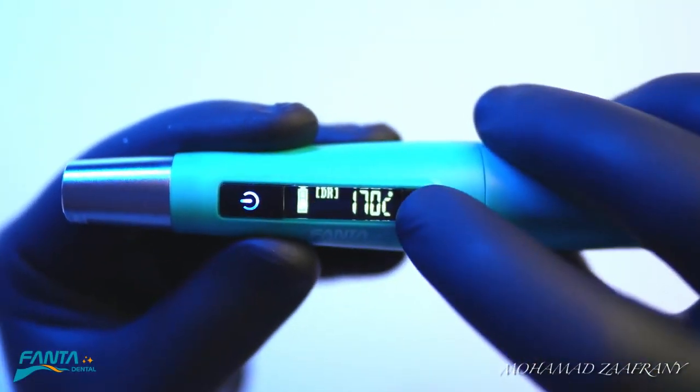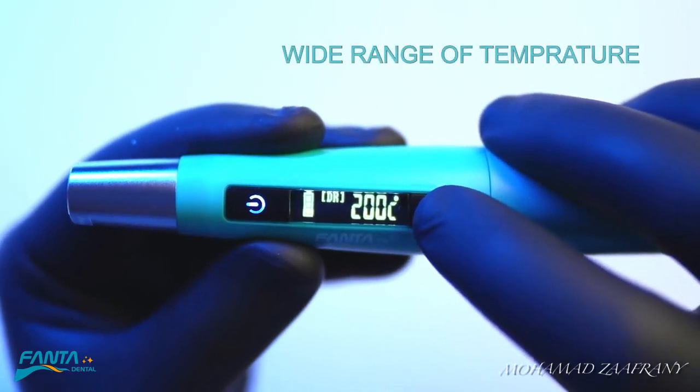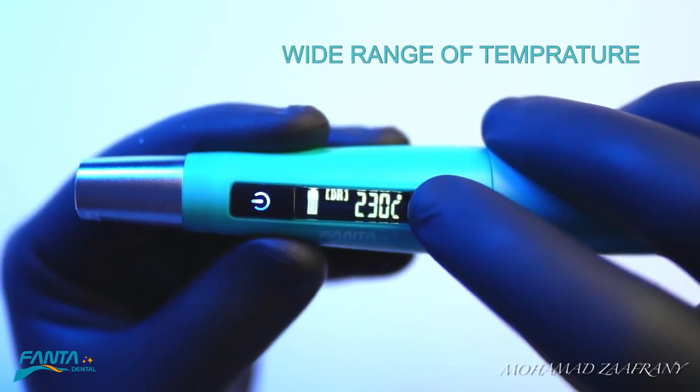The E-Heater from Fanta has a wide range of temperatures, so it can fit different clinical applications.